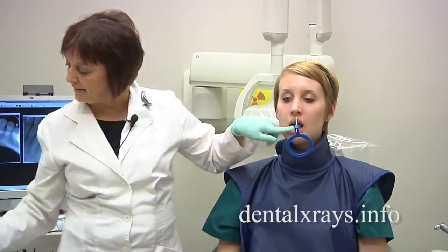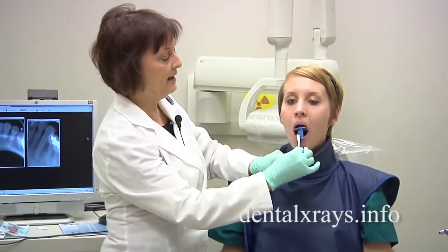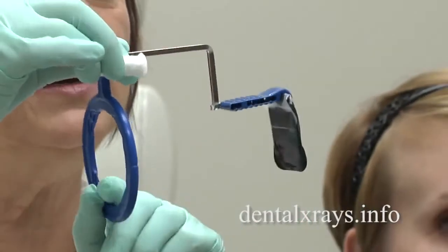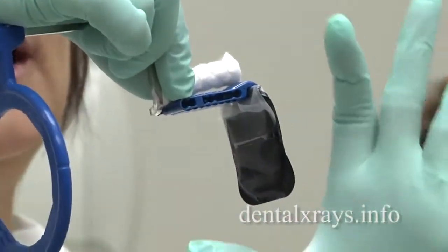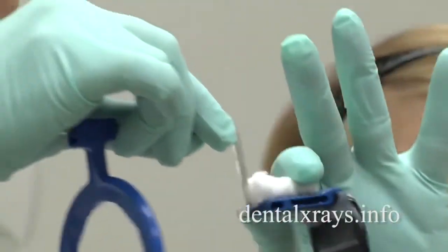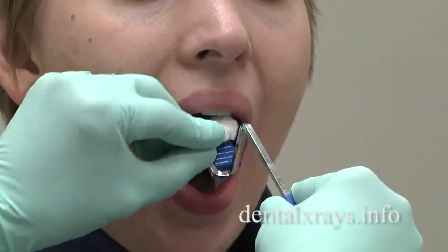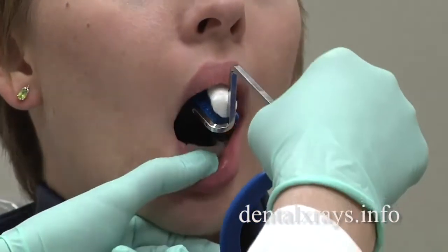What helps sometimes is if you use a cotton roll. Right now I'm going to take that out — she really has to close to reach this bite block. To make it easier on the patient, if you actually put a cotton roll on the upper part of the bite block, she will be able to secure the whole unit in her mouth a little more easily. So I'm going to put it way back there to fit, roll it up, and then put the cotton roll right under the front teeth and have her close and bite.